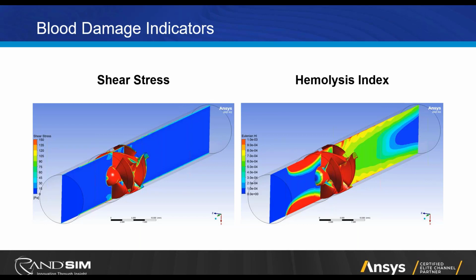And the magnitude of that hemolysis index is not really what's important. It's relative to your future design. Say, let's try to improve that, and then we compare the hemolysis predictions between design A and design B. What I did here was balance it with the shear stress plot so we could make a comparison between the two. I'm trying to highlight what you would miss by just looking at shear stress as opposed to shear stress and hemolysis in these simulations. Hemolysis models are relatively new. They've been around a while, but mostly in academia. These days, they are used more widely in the industry.